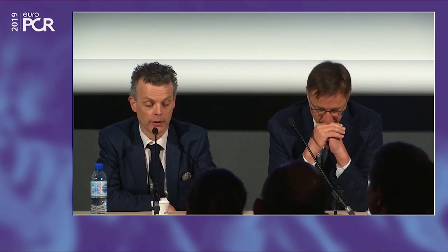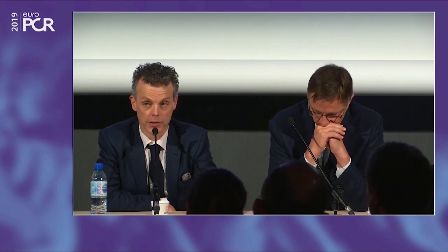Just one more point, actually, from the audience to take away. Ewald is looking at an OCT study in the left main, and when he refers to abluminal wiring, of course, that in itself doesn't cause an issue. But if you try and balloon a stent after abluminal wiring, you can make an absolute mess of the left main. And I think angiographically, you can be falsely reassured that you've got a good result. And actually, when Ewald and Niall shared the data about the incidence of abluminal wiring with me, I was appalled at how high it was. So I think it is one of these red flag areas that, as an interventional group, we have to be more meticulous about.